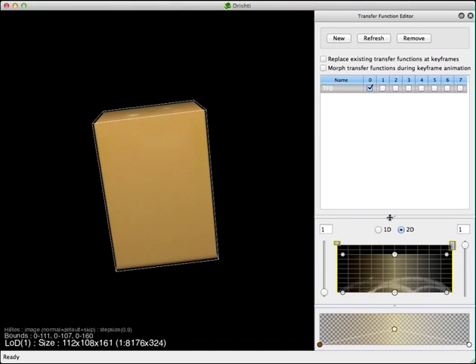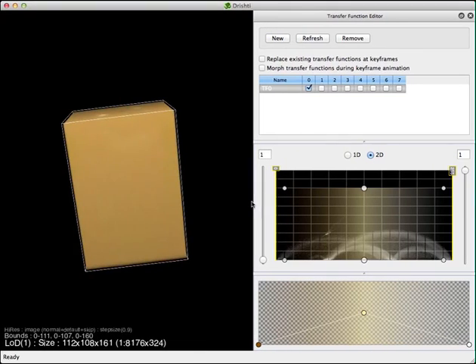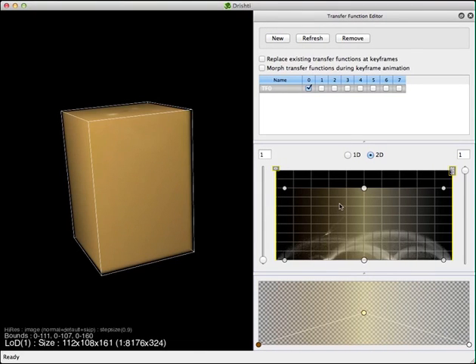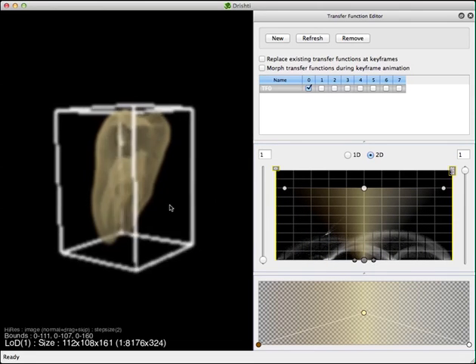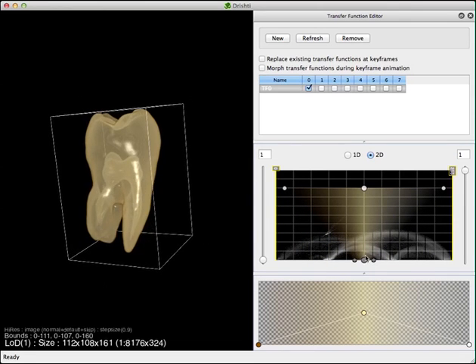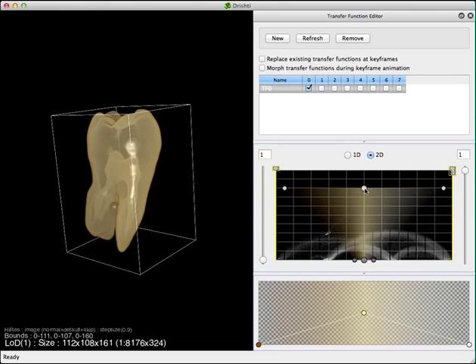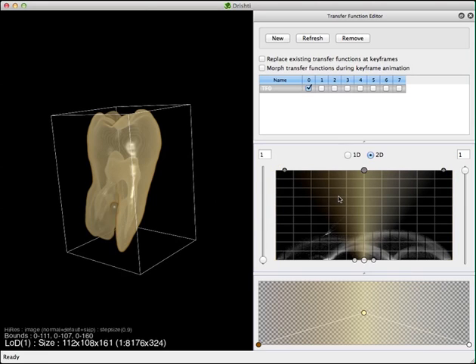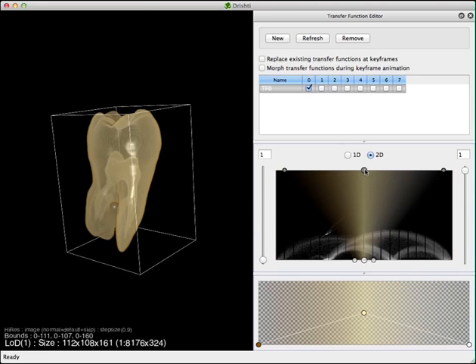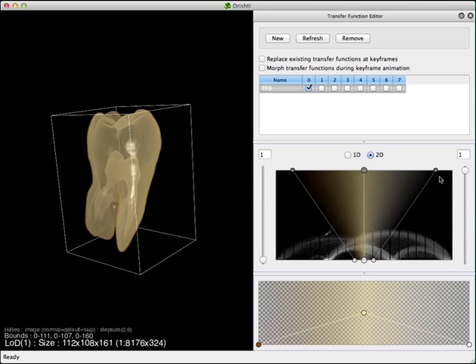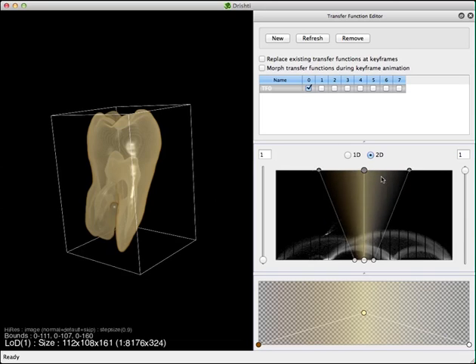Now let's play with the transfer function. I'm using Shift and the left mouse button to change the size of the transfer function. Let me remove these markers. This line here is what I call the spine of the transfer function.